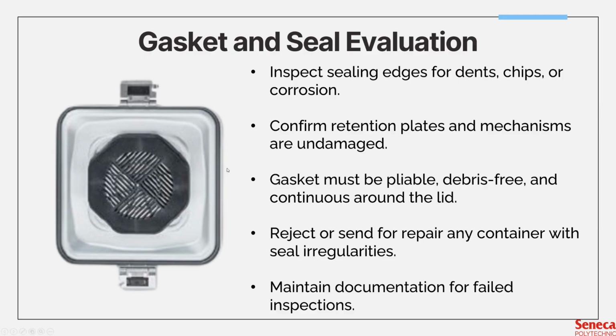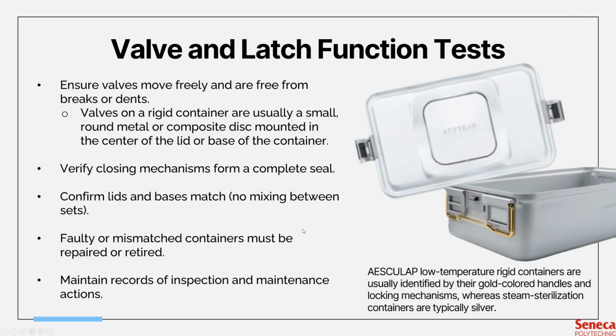And when you see something like that, like a gasket that's cracked or deformed, you would have to send the container set out for repair. And of course, if you find any failed inspections, you would have to document it and report it immediately according to department policy.